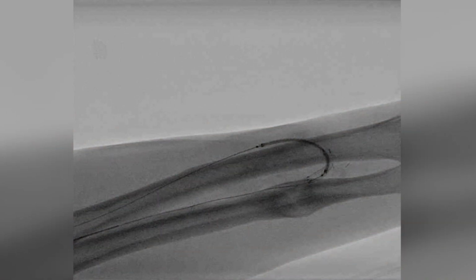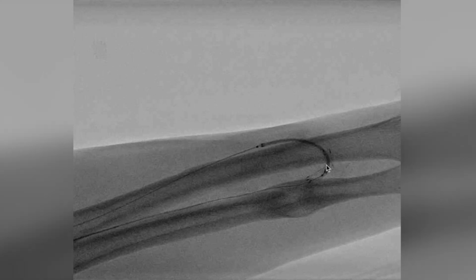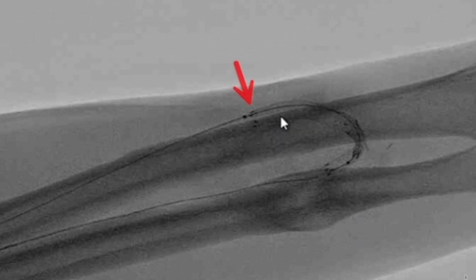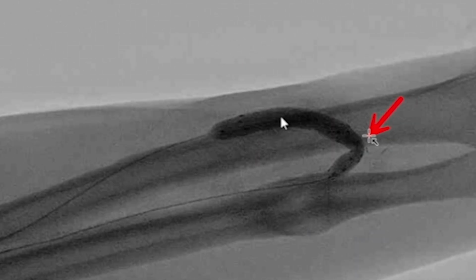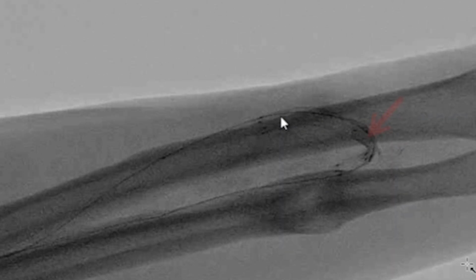We then placed a Viabahn going from the radial artery through the anastomosis into the cephalic vein, going from here to here, and the stents were deployed. Now at this point, we could post-dilate vigorously the area of stenosis since we had a covered stent there.